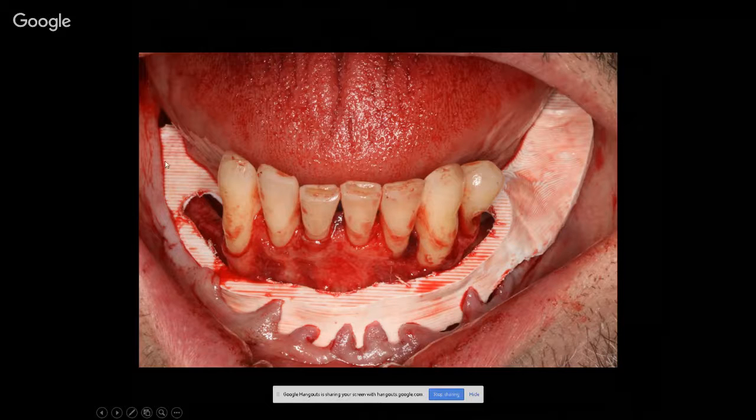You have to pull the tissue to surround the surgical guide on the buccal and the lingual, and do the same thing on both sides before you're able to push down on this guide to hear an audible click on the mandible for this guide to actually lock into place. Once completely seated, and you have to make sure that all the soft tissue is out of the way on both sides, buccal and lingually, then you're able to go ahead and reduce the mandible.